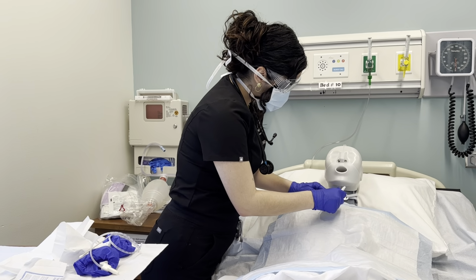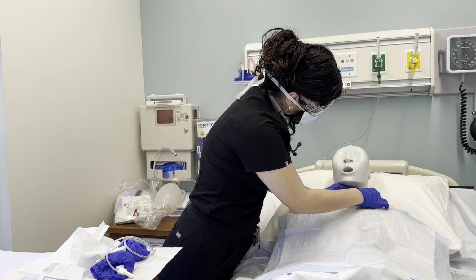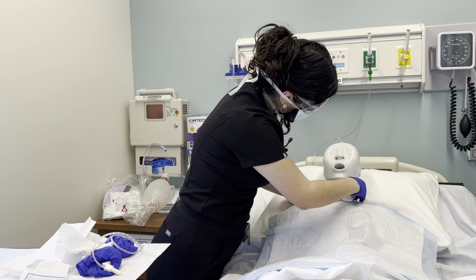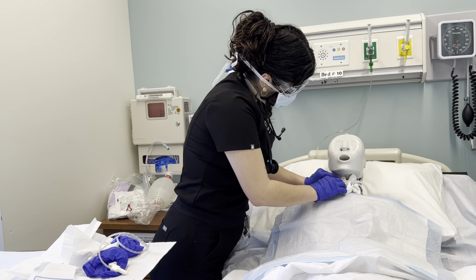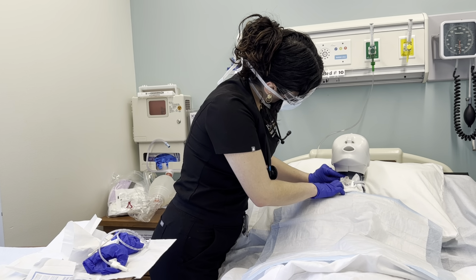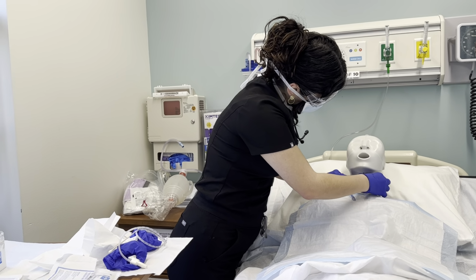Is it okay with you if I place the sterile tray gauze? I'll place it under the plate and I'm going to carefully do it so that the patient doesn't end up coughing and becoming uncomfortable. I'm going to place a bath blanket over you.